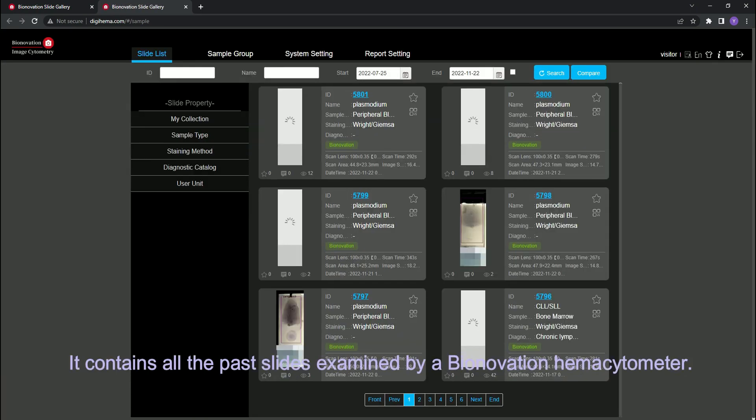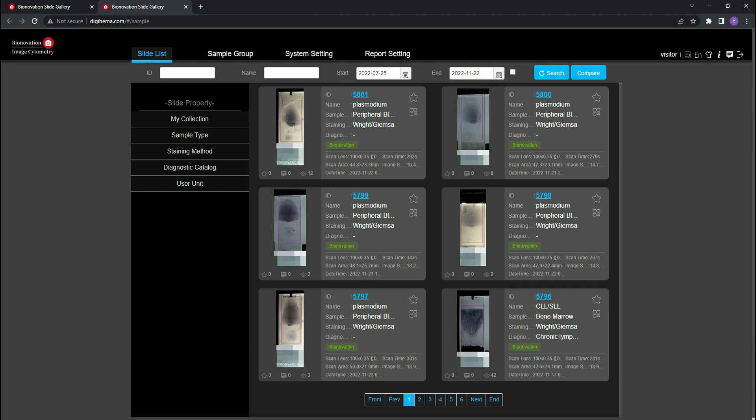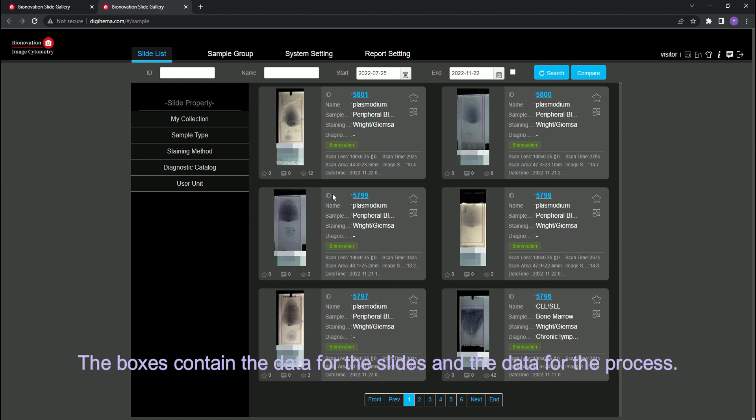It contains all the past slides examined by a Binovation hemocytometer. The most recent scans will show up on the home page. The boxes contain data for the slides and data for the process.